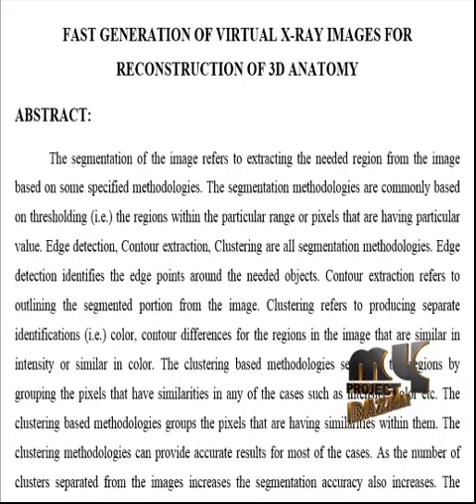Segmentation methodologies are commonly based on thresholding, that is, the regions within a particular range or pixels having a particular value. Edge detection, contour extraction, and clustering are all common segmentation methodologies.